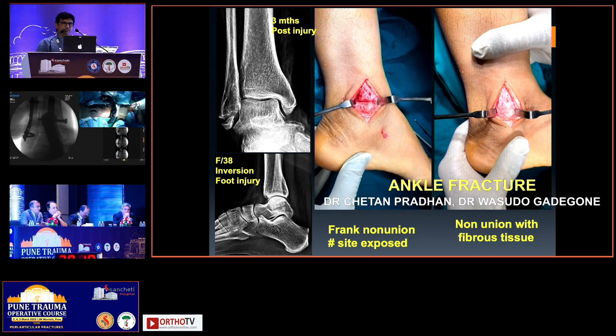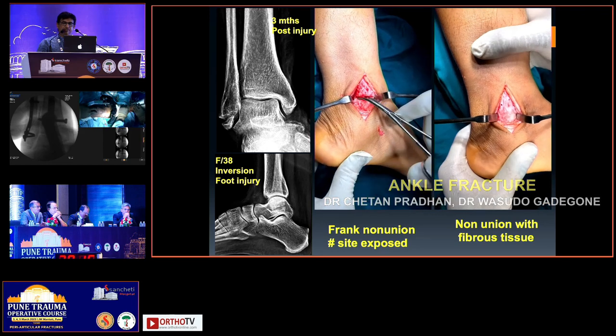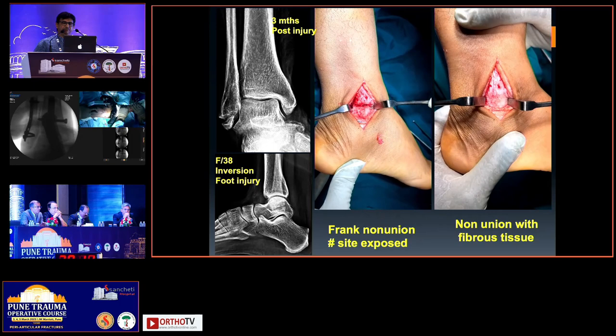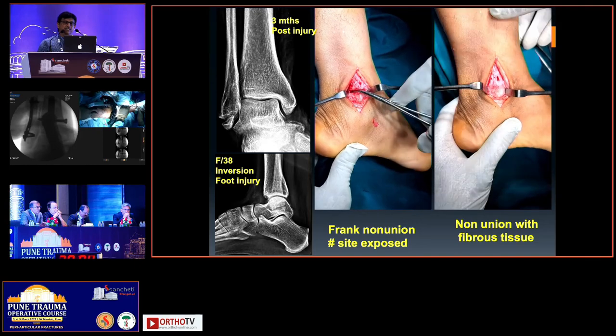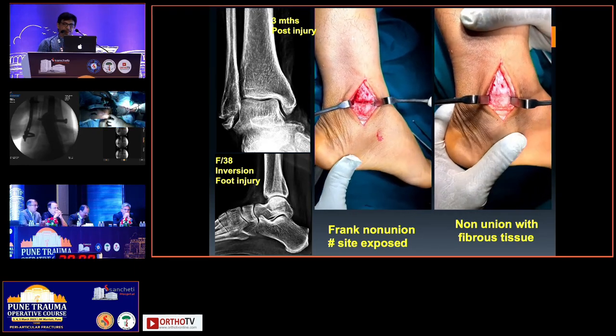This was the on-table situation. This was before excision of the fibrous tissue, and this side after excision of fibrous tissue, the fracture site is opening. So that was the instability demonstrated. The fracture was completely open like that.